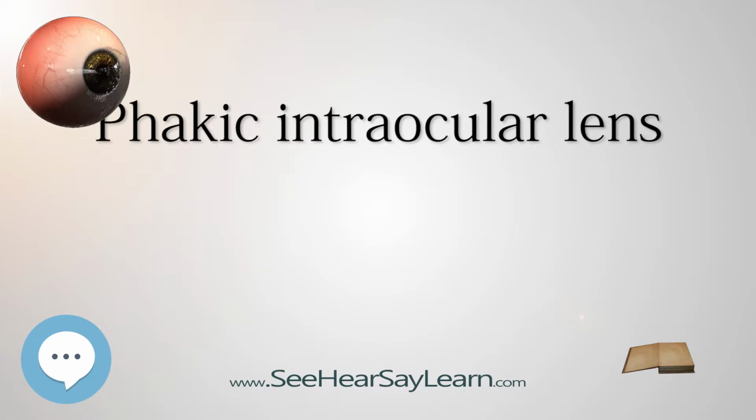Advantages. PIOLs have the advantage of treating a much larger range of myopic and hyperopic refractive errors than can be safely and effectively treated with corneal refractive surgery. The skills required for insertion are, with a few exceptions, similar to those used in cataract surgery. The equipment is significantly less expensive than an excimer laser and is similar to that used for cataract surgery. In addition, the PIOL is removable, therefore, the refractive effect should theoretically be reversible. However, any intervening damage caused by the PIOL would most likely be permanent.